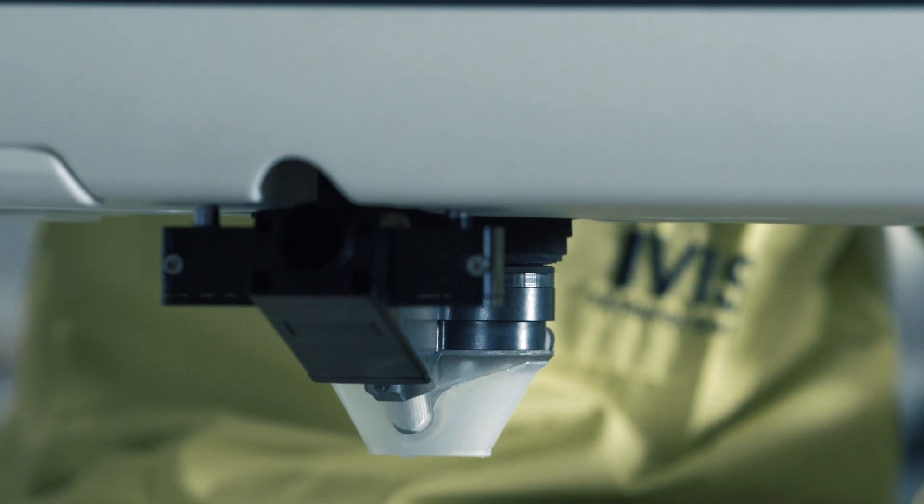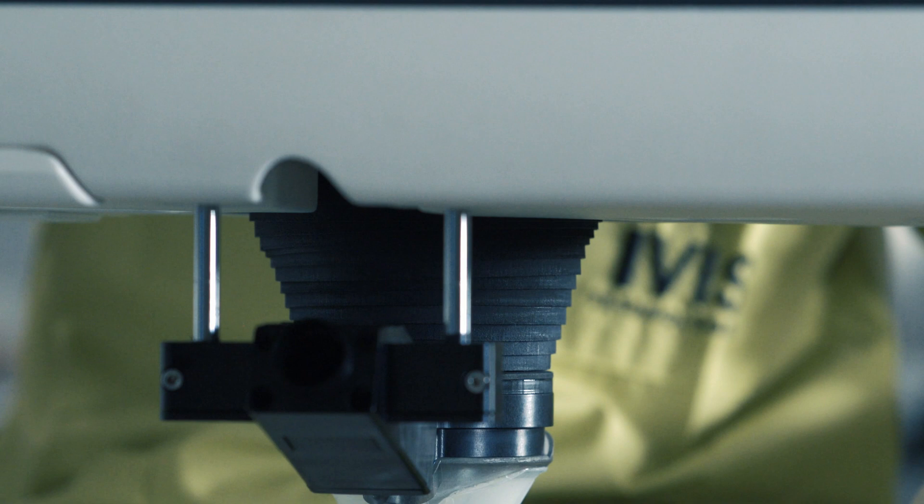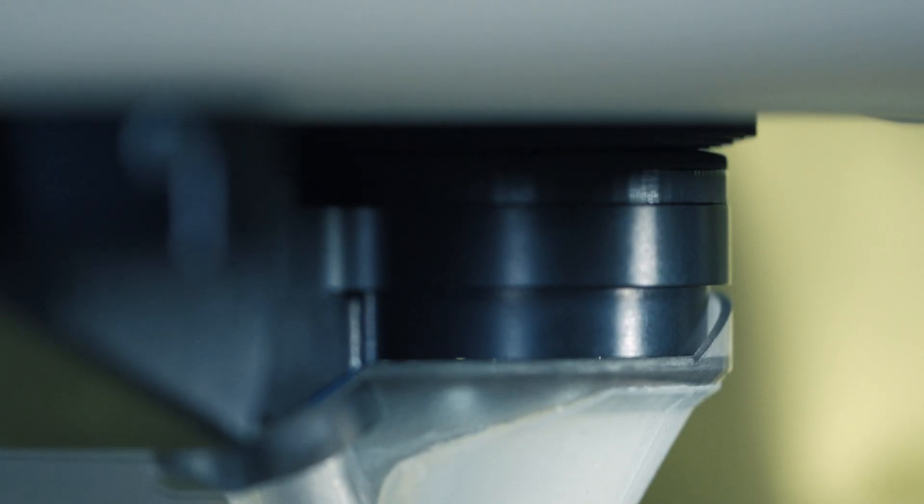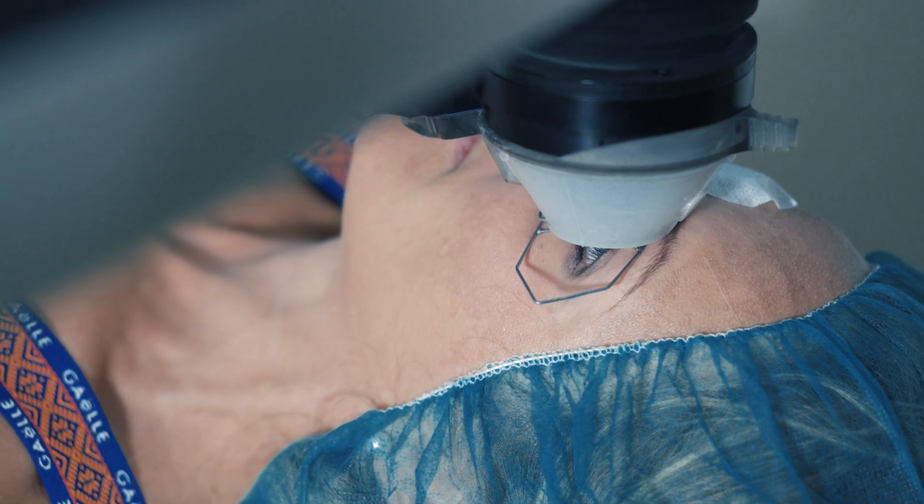IRIS 2 incorporates the patented air system controller connected to the patient's face utilizing disposable eyepieces to eliminate system dependency on environmental conditions.